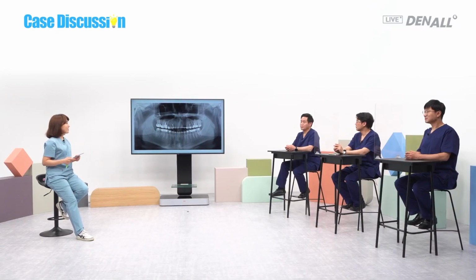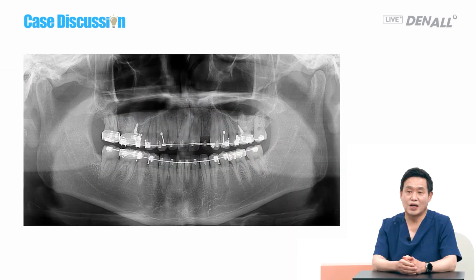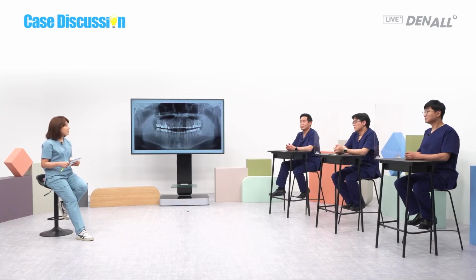What do you think, Dr. Kim Kyung-won? First of all, on the maxilla, the lateral teeth space is very narrow. As the dentist who sent us the question said, sometimes we use a one-body implant, but we need to be careful when we choose that for the maxilla. Professor Kim Young-taek, I don't think this is a very challenging case. It's worth discussing what others are thinking in this kind of case. I believe the patient was referred by the orthodontic department, so maybe we need to discuss this matter with that department as well. We can enjoy the discussion here.